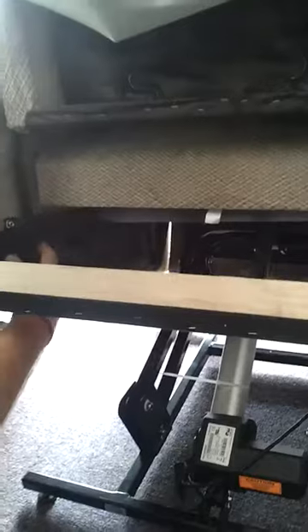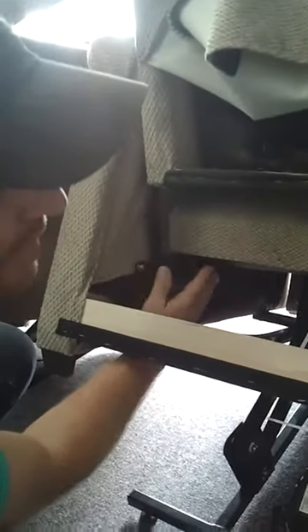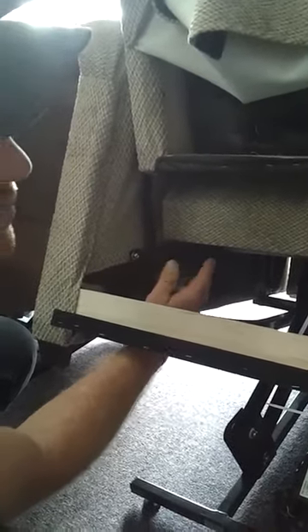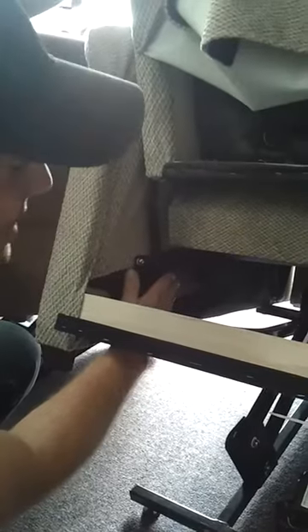A good thing about the scissor mechanisms is they're a lifetime warranty. Most times you would get free shipping and free scissor mechanisms, but you would have to pay for someone to replace them because it is tedious work — you have to take the whole chair apart to replace these. You usually want to replace both of them, not just one.